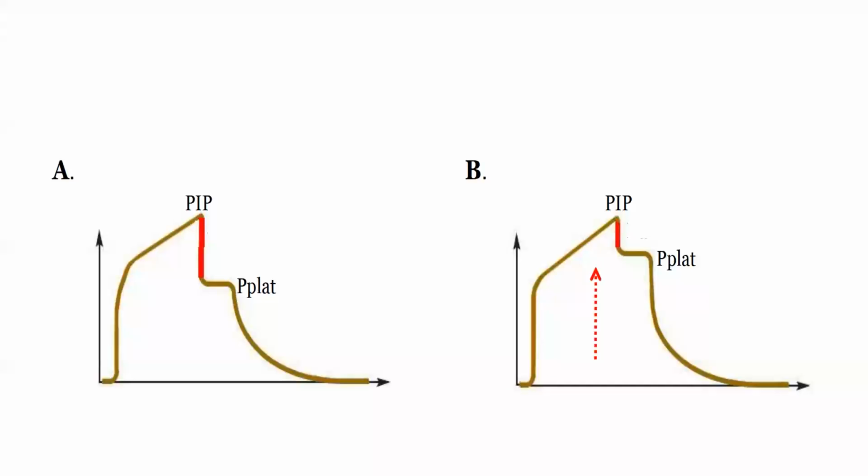And patient related, it is bronchospasm. Okay, correct. So bronchospasm, or there's any kink in the tubes, a blocked HME filter, a very common cause, or a blocked tube by mucus plugs or secretions. So these are common causes where you will have increased peak inspiratory pressure because of increased resistance.